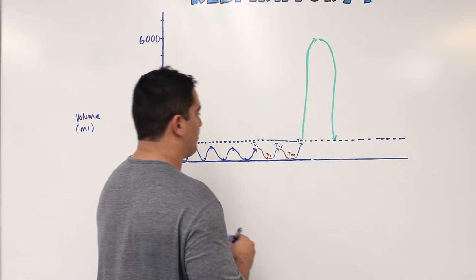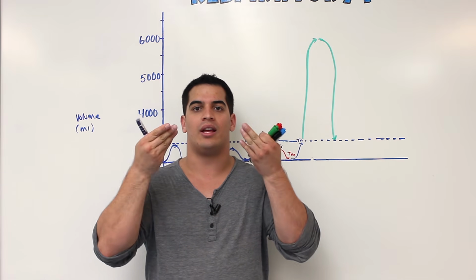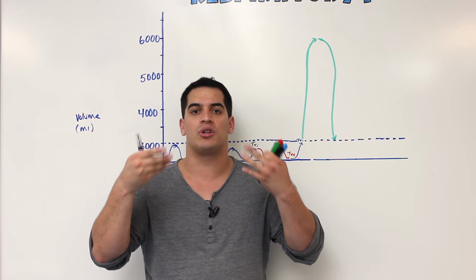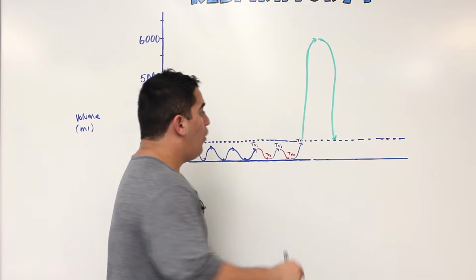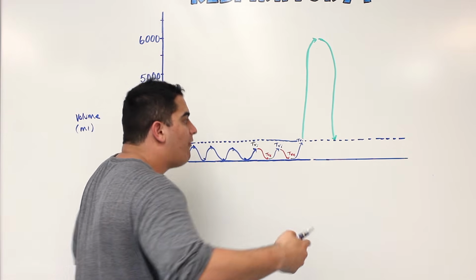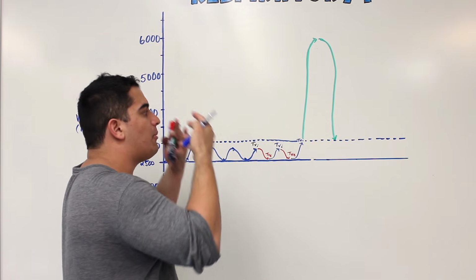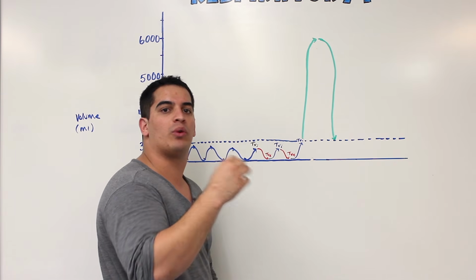So now look what happens. Bring in normal tidal volume inspiration, right? Just breathing normally. Once I bring in my normal breath, I forcefully inspire. That point at which I'm inspiring is going all the way up here. I'm forcing inspiration. I'm forcing a certain amount of volume in. This point here is called my inspiratory reserve volume.